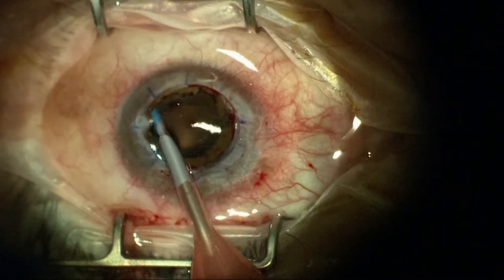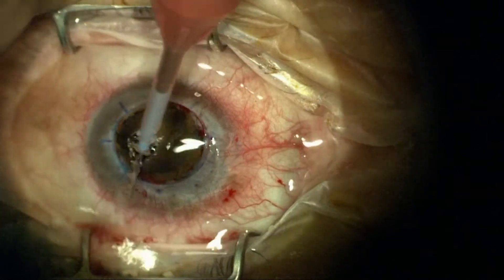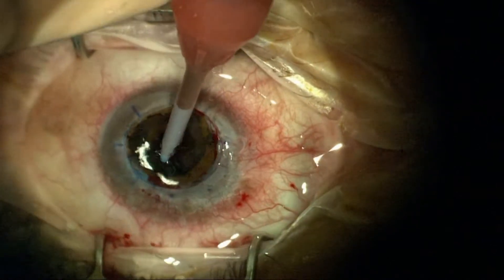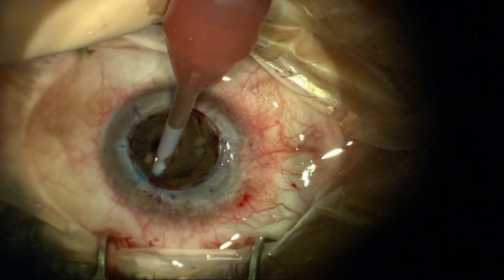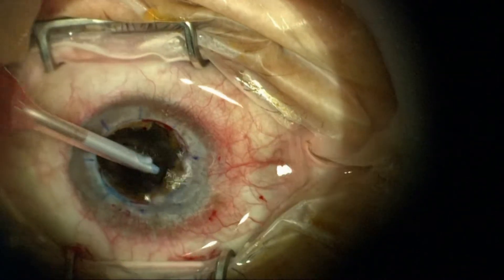We'll use an irrigation-aspiration unit. Since it's not a closed system, I'm using a high flow state that essentially flushes a lot of the cortex out of the capsular fornix, also removed with vacuum.